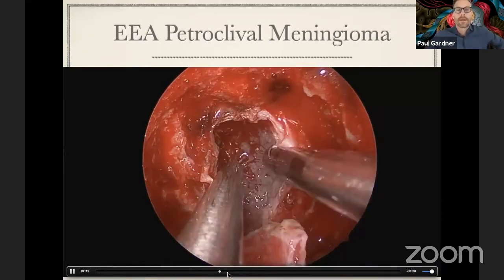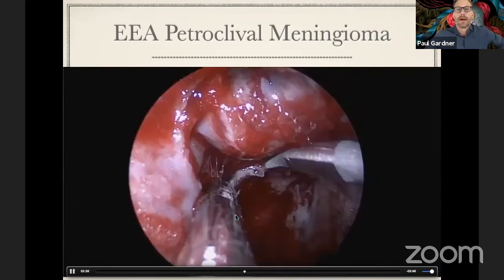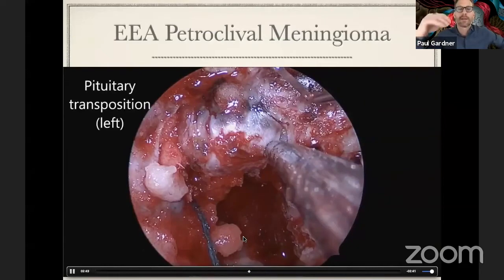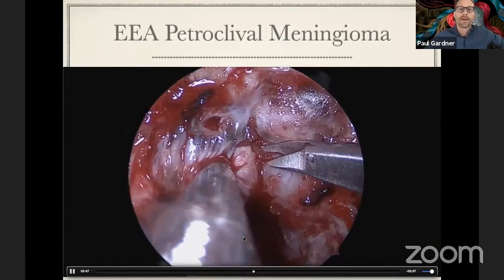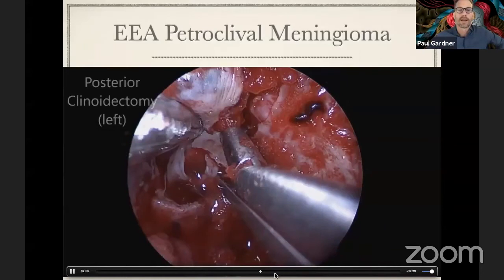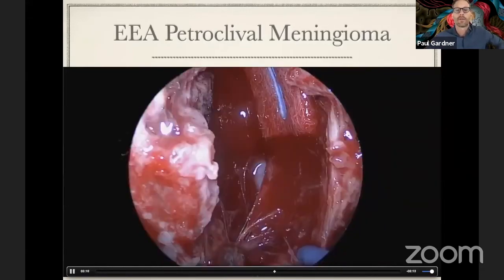Now to continue with the debulking of this, we have to do the pituitary transposition that Dr. Fernandez-Miranda has so elegantly described. I would encourage everyone to look up this technique as well as his work on cavernous sinus. He put a tremendous amount of effort into this, but it's a beautiful example of how we learned from the lab and are able to transition this into patients.